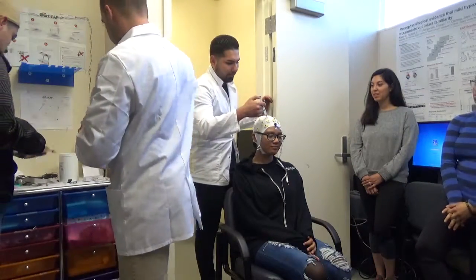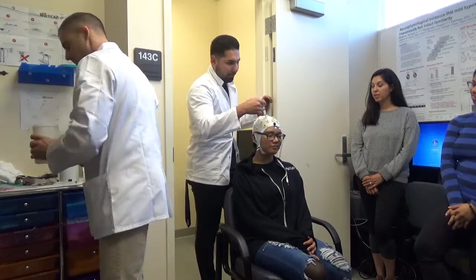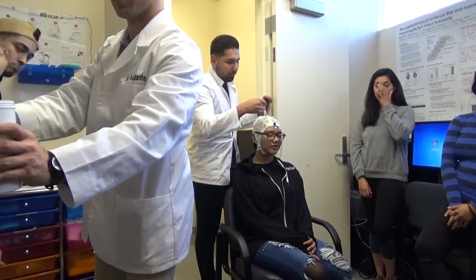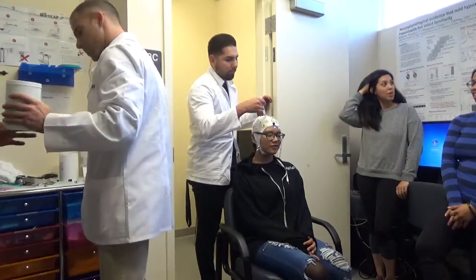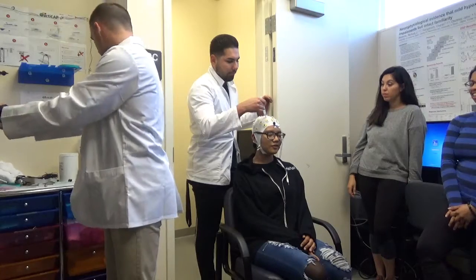You're laughing and making it difficult for him. Sorry. Do you feel it? More pressure. Fill that up a little bit. Cool. You have to create like a little pathway. There's like no pressure at all. That's what I'm saying, you gotta have her feel it. Just go back and forth. Can you connect that? Okay.